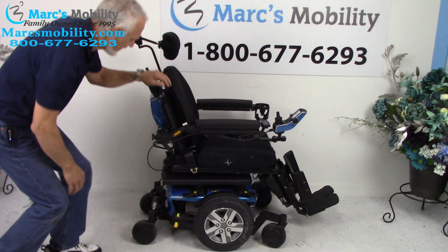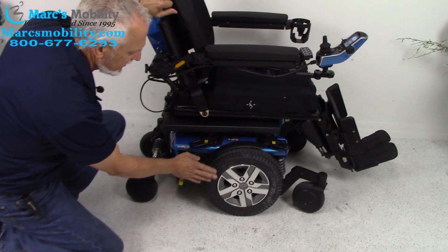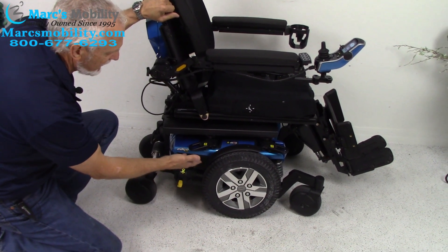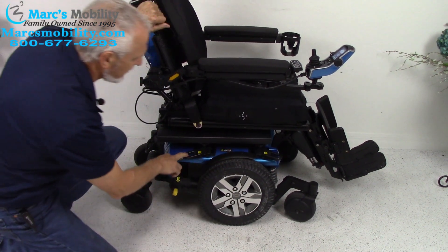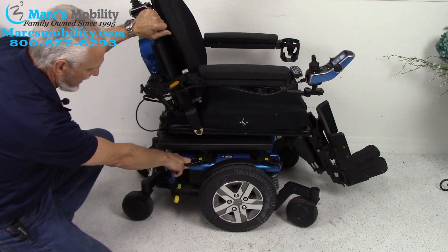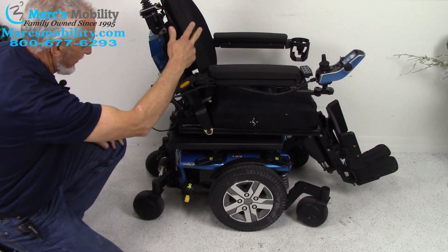Let's look at the base. The base on this chair has 14-inch solid wheels, non-skid wheels, caster wheels in the front, and caster wheels in the back. We've also got secure points right here — this is where you would secure your chair to your lift or to your van if you're going to transport this chair. There are two on this side and two on the opposite side.